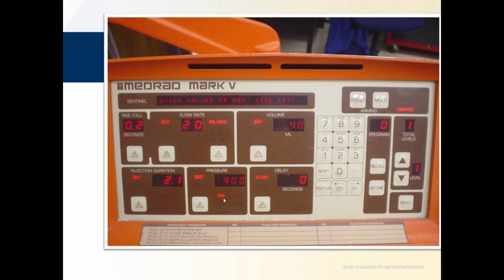And then finally we get to the pressure setting. This can be set anywhere from 1 up to, I want to say this unit will do 1200 psi. And that's kind of about the pressure that you would be using at a coin-op car wash, 1200 to 1500 psi to spray off your car. Why do we need the high pressure? Well, you have to remember the lumen of the catheter is very small, and so you get a lot of friction in there, and so it takes a high pressure injection to get the flow rate that's desired.